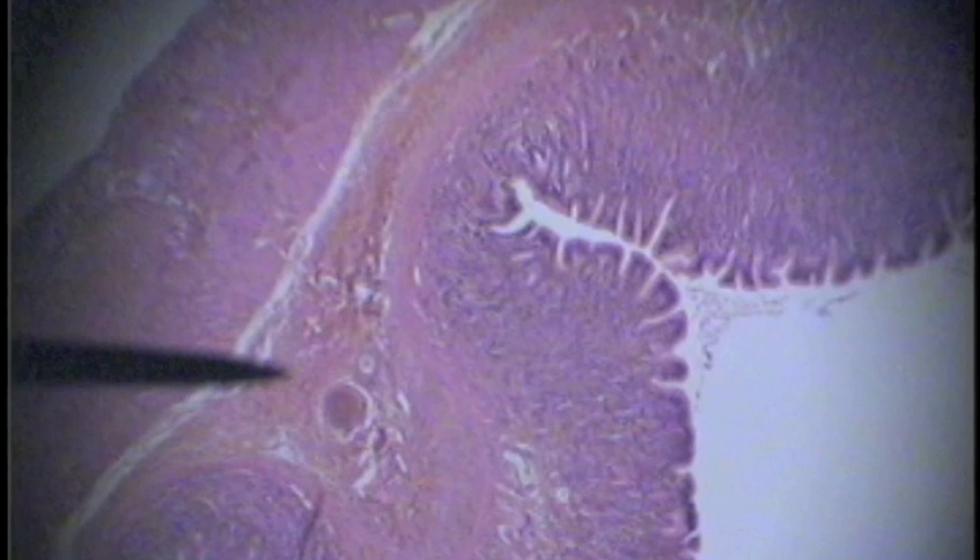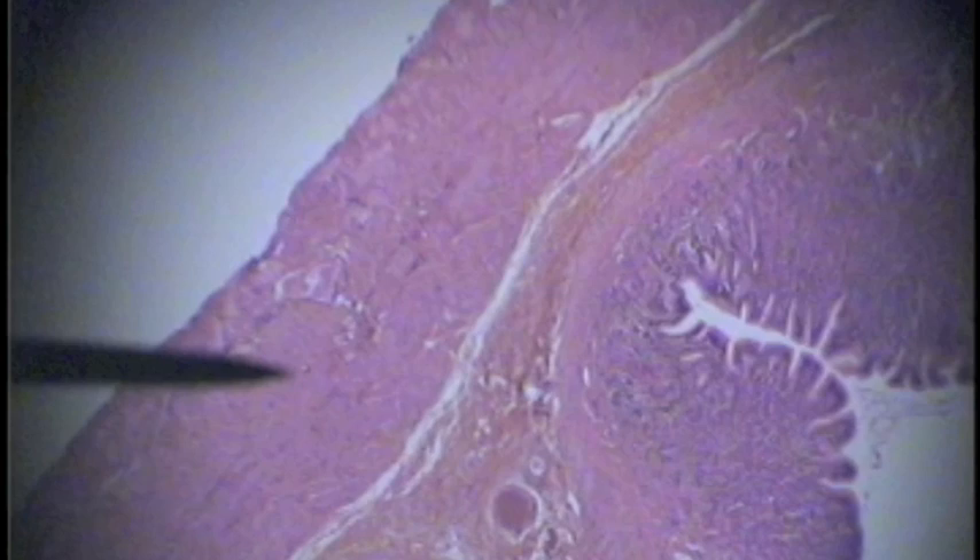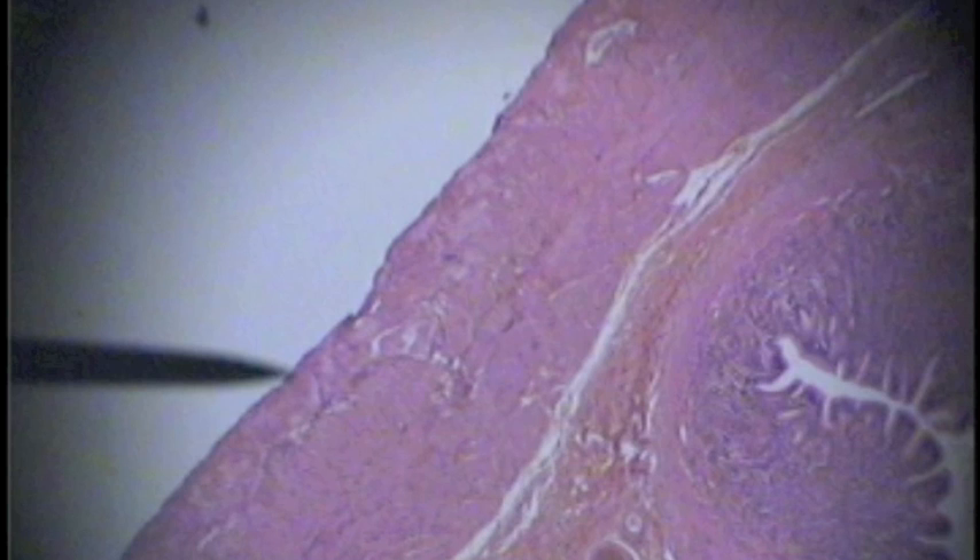Here the pointer is in the submucosa of the stomach. Now we're in the tunica muscularis. Indicated here is the tunica cirrosa. The pointer here is in a gastric pit.